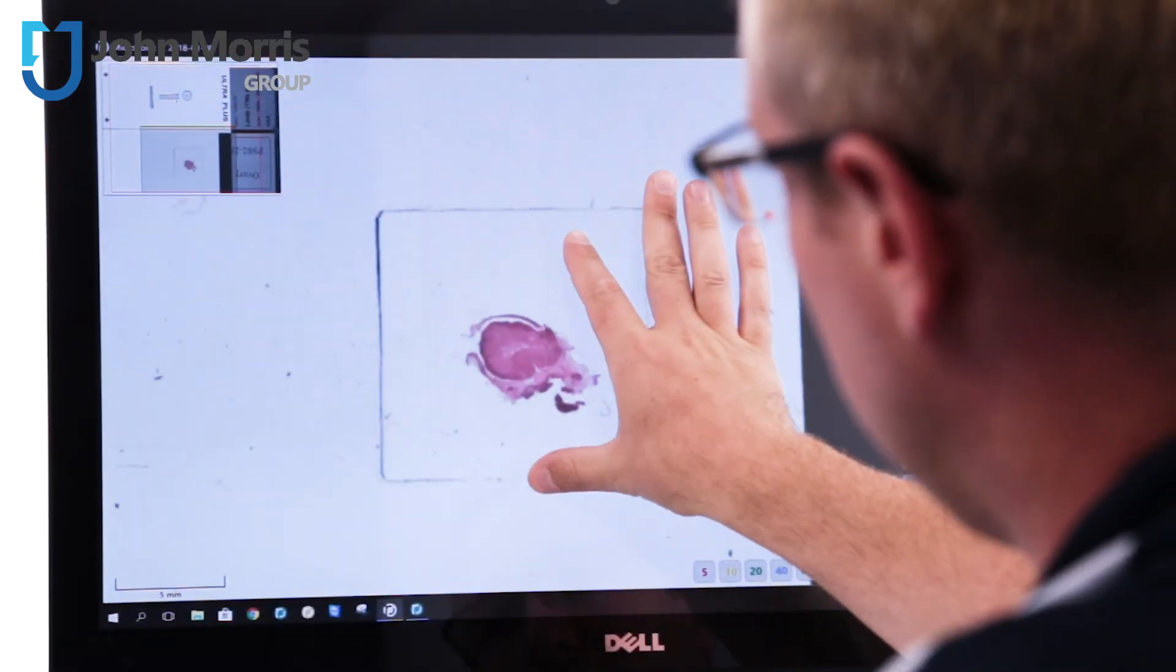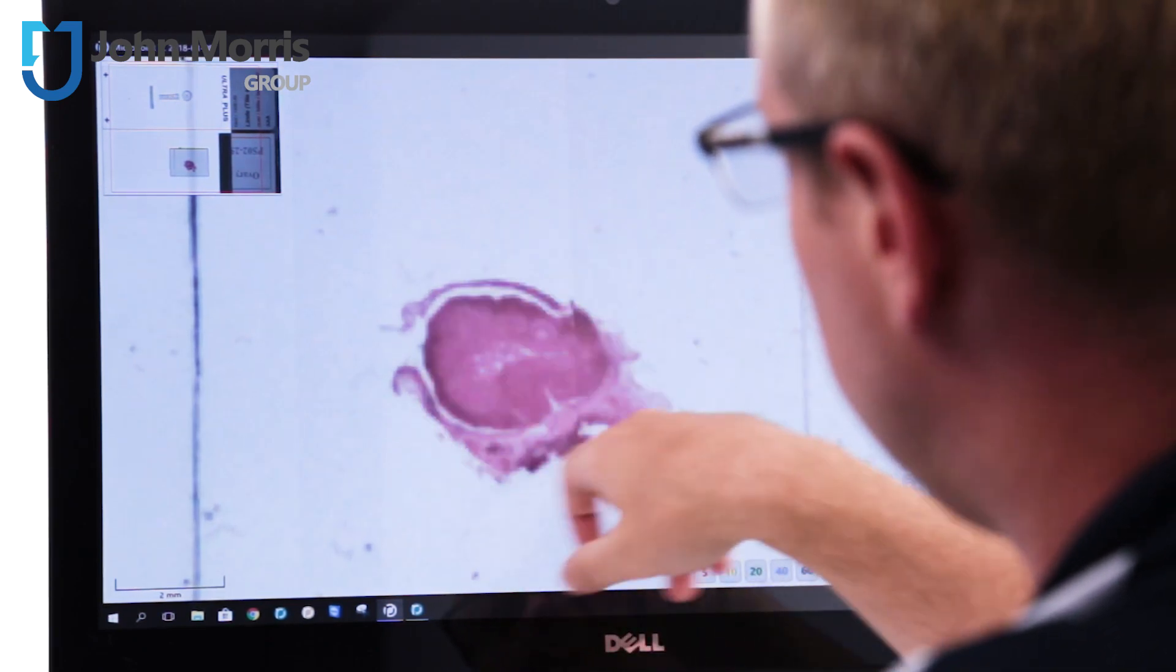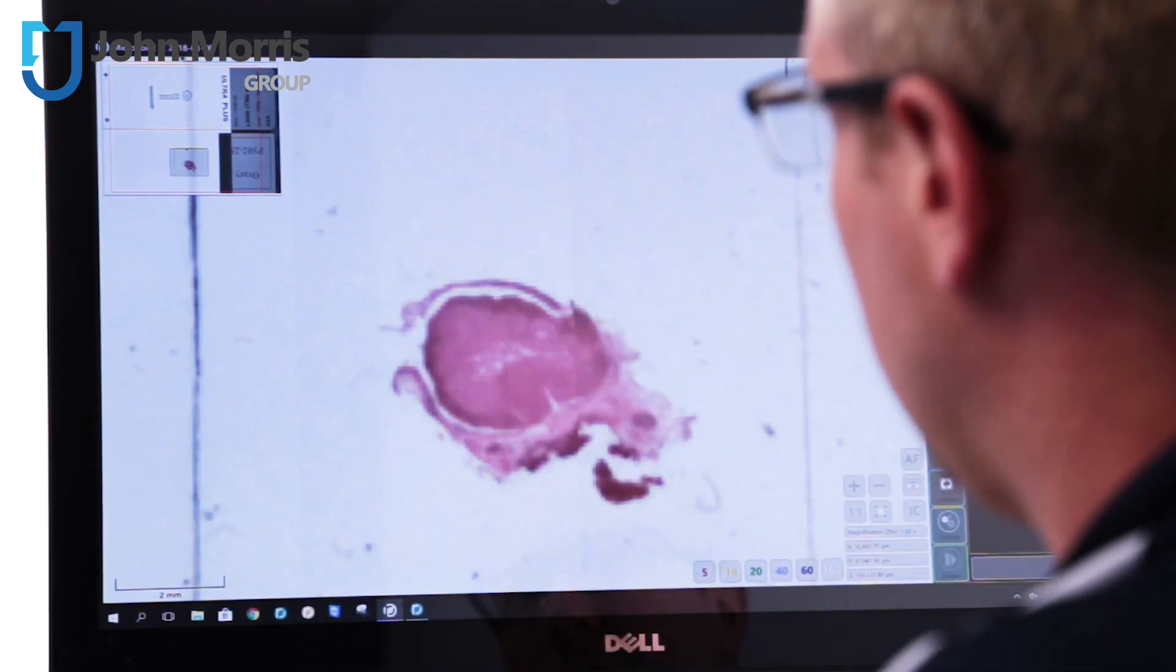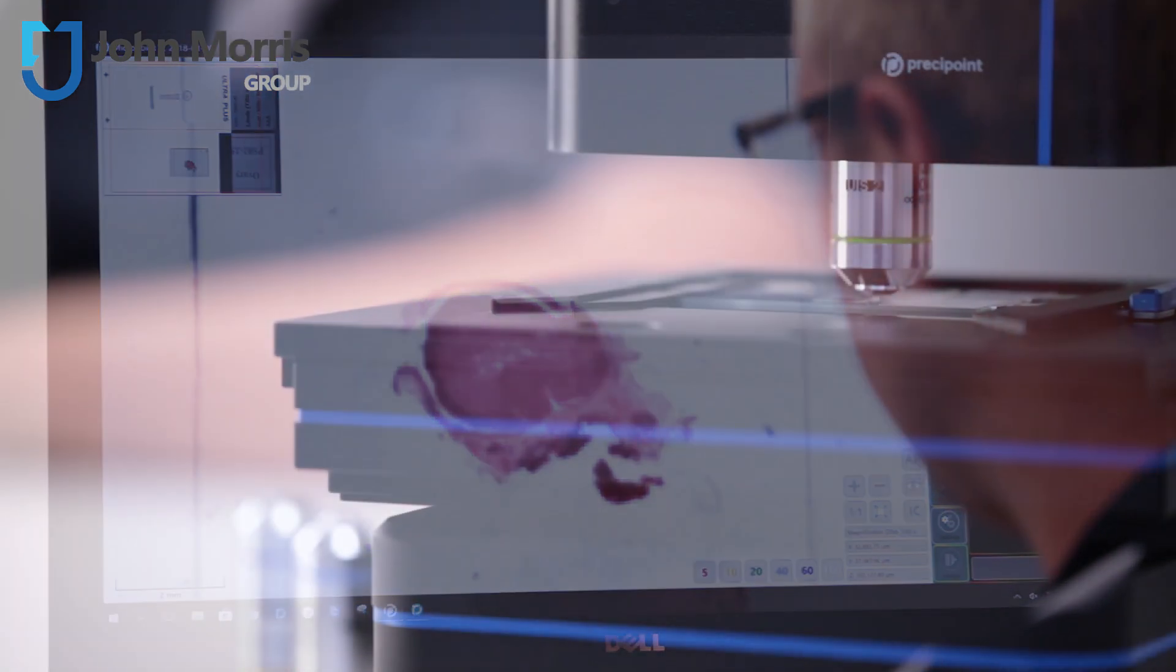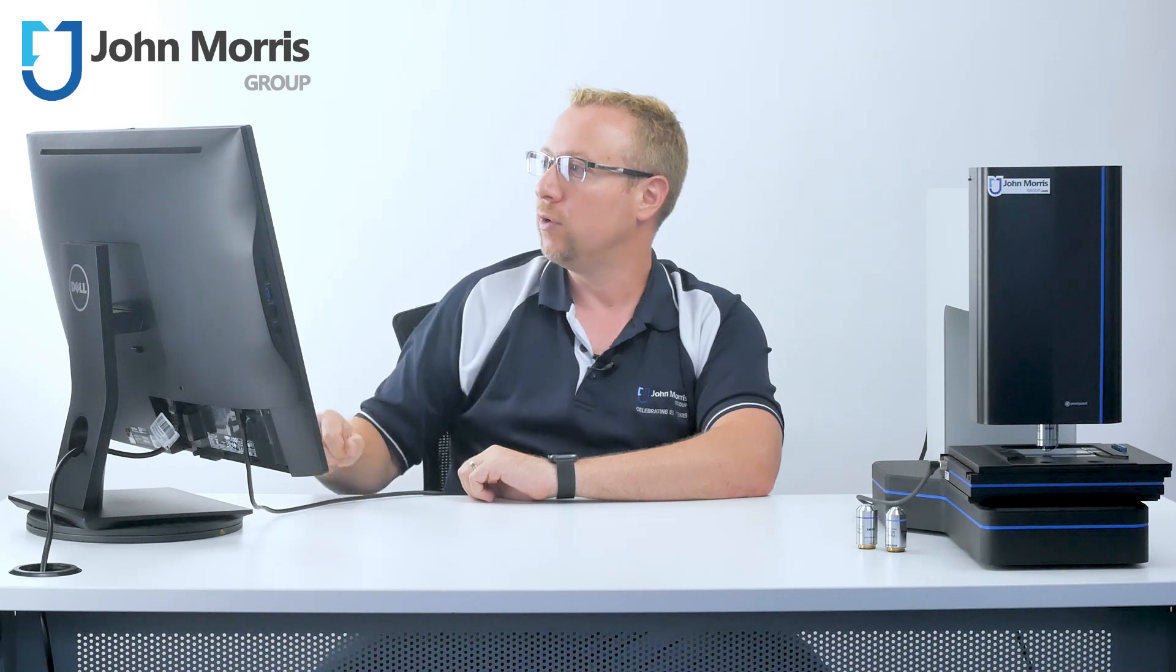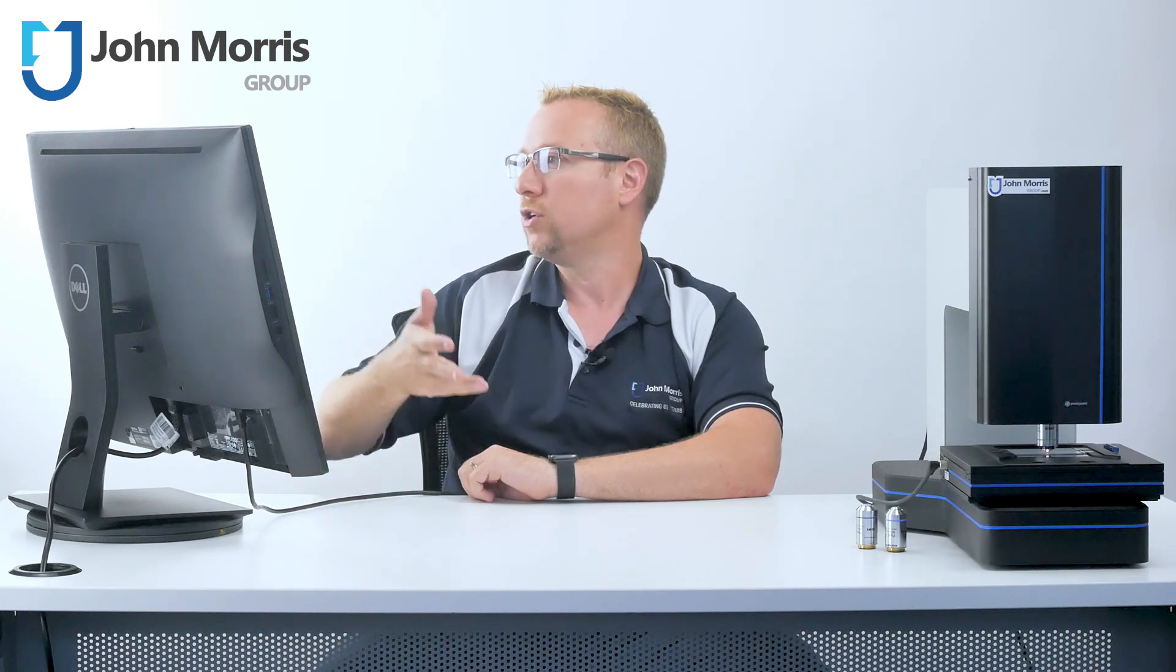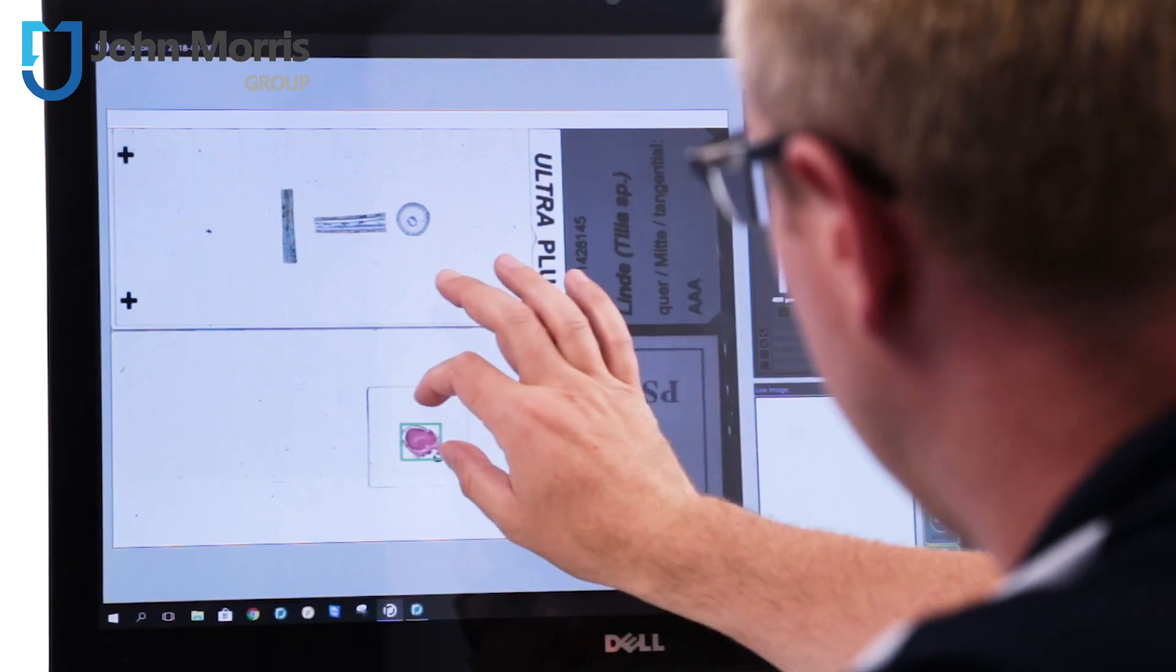So you can see here, we have a cross section of a rat ovary and that's just working its way through now to resolve this particular image for us. We're currently in instant scan mode but what we're going to do is go across to scanning mode and here we go.